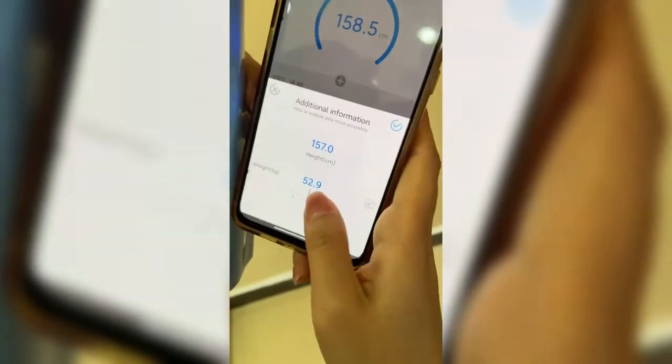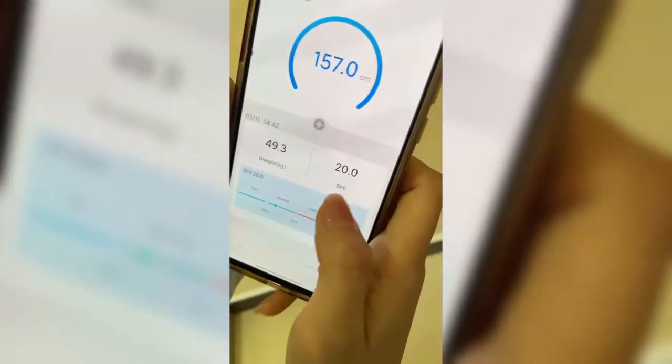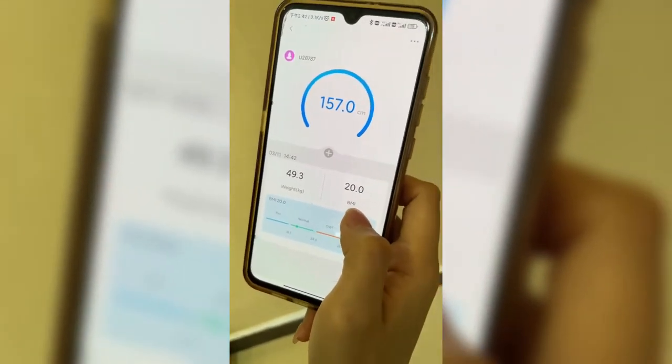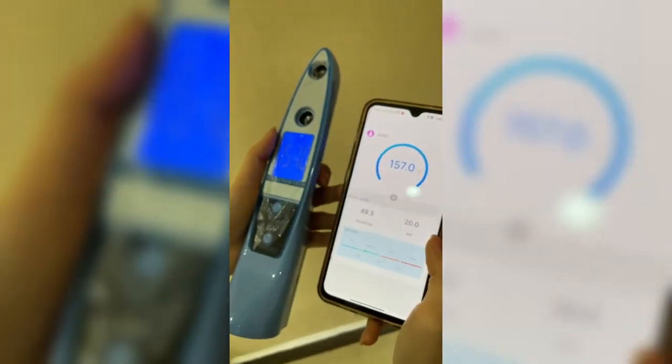Then we can choose our weight, so it will show you the BMI, because it now has the height and weight and will display your BMI. That's how it works — thank you.